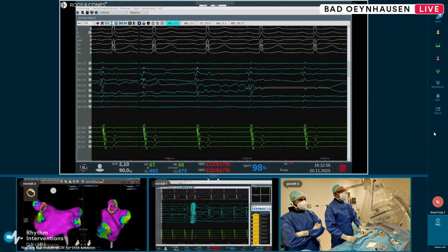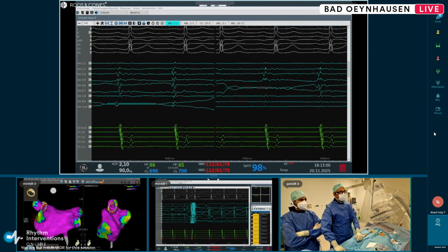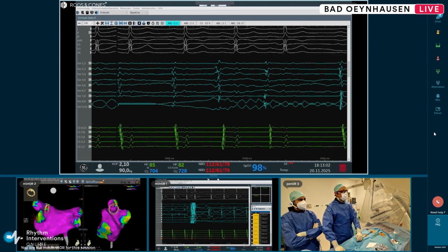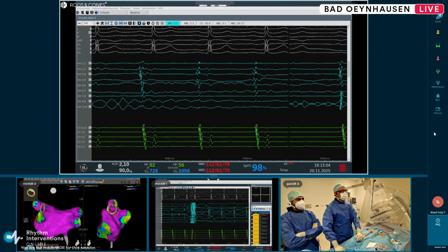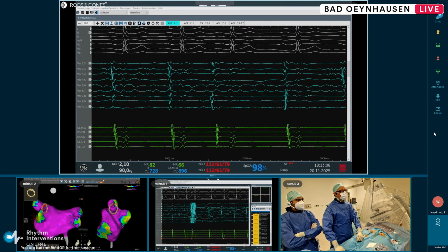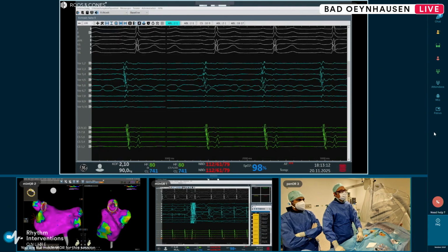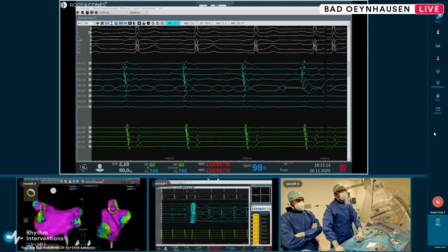So we can still rotate the catheter a little bit, which is also useful to take into account the catheter design. We go now a little bit more ostial. Please also show us the bubbles, Mr. Ertem, and then if it's okay so far, we will conduct the next application in this area. So please start, and please put the bullseye in the middle.